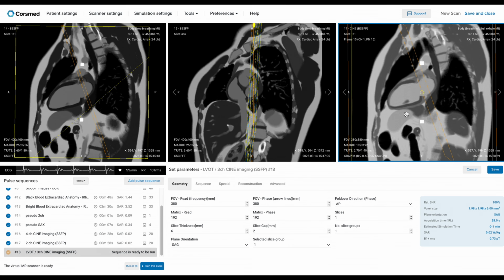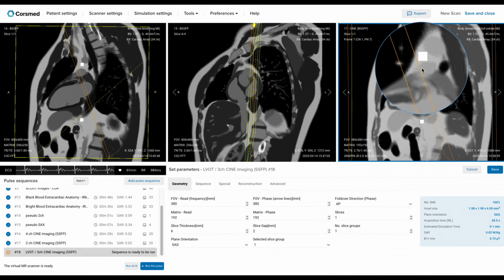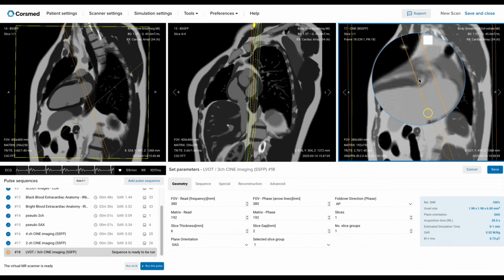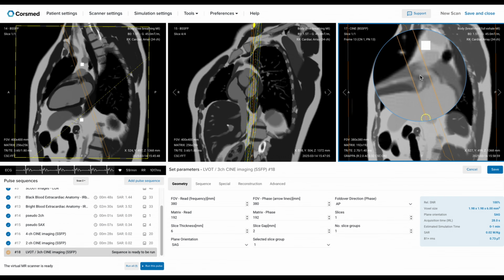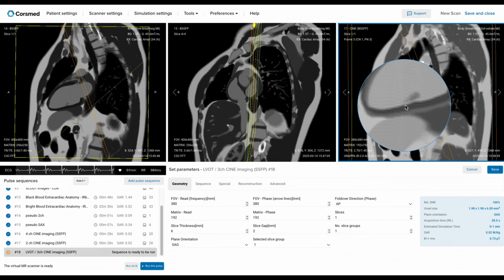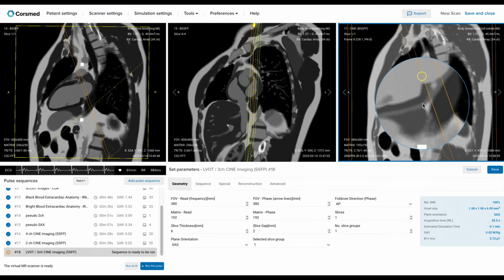Now, let's take a look at the two-chamber image we just acquired. It looks nice and clear. We can see the left atrial appendage here, and there's a faint view of the pulmonary artery that doesn't interfere, so we can see the appendage correctly. This is a key feature that tells us our two-chamber view is properly acquired. As you can see, we can visualize the entire left ventricle cavity. We don't see the right ventricle below it, which is ideal.